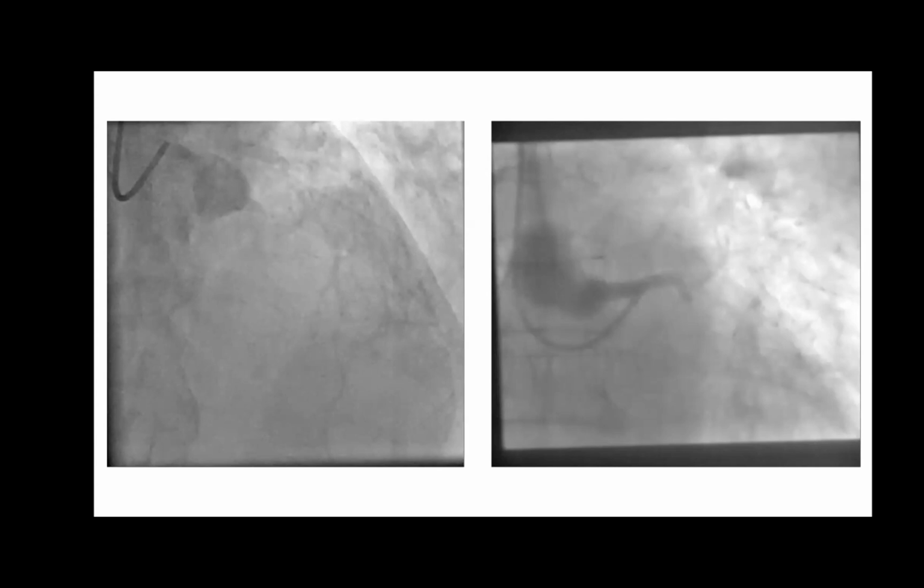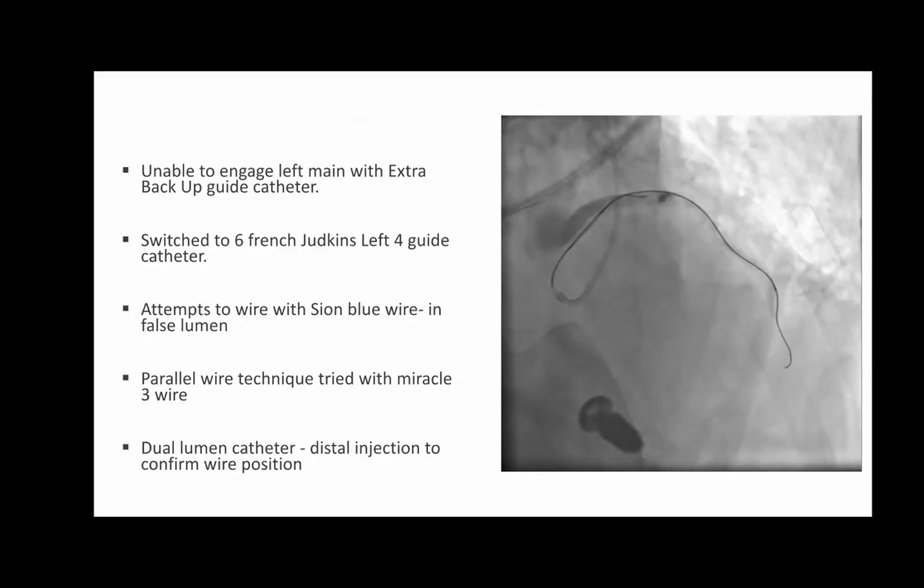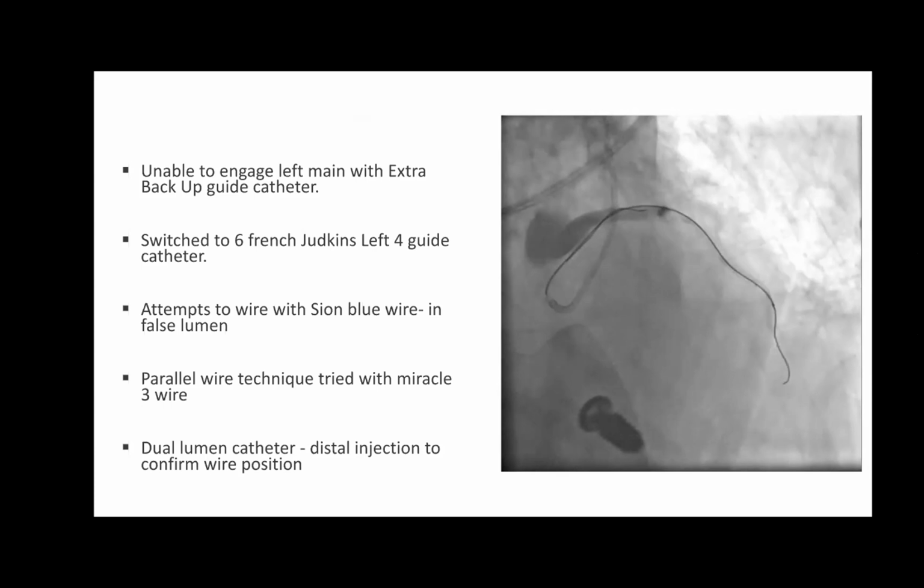So the main point was that the guide wasn't sitting properly, and that's the mistake on this side, and quite a dear mistake, I would say. He had a type F left main stem dissection, which is usually incompatible with life. When this happened, because this was an elective case, we put the pads on. We called out cardiac arrest as well, and called for help from our senior colleagues who were luckily nearby, and also called the surgeons.